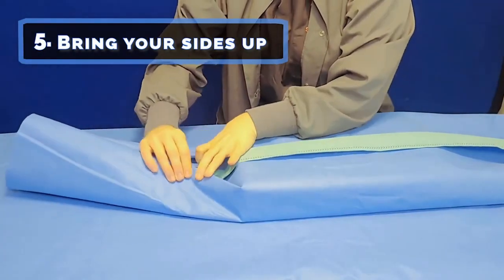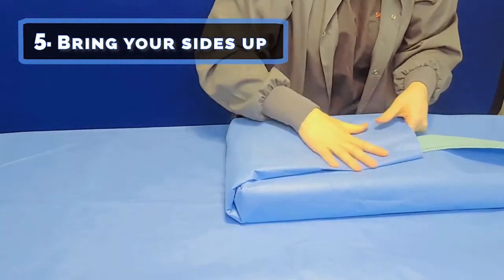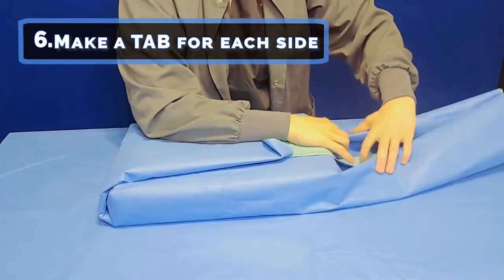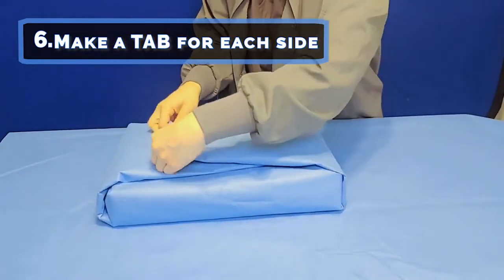Step six: make a tab for each side. Let's watch that again for the opposite side — taper, grab, fold over, tab.